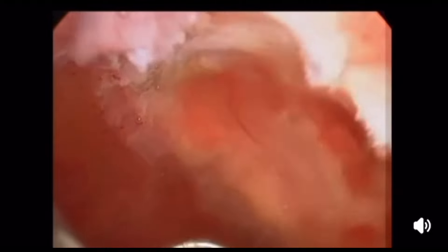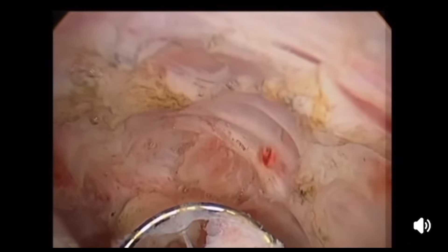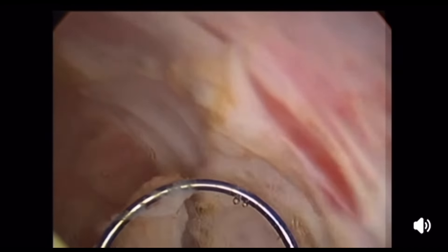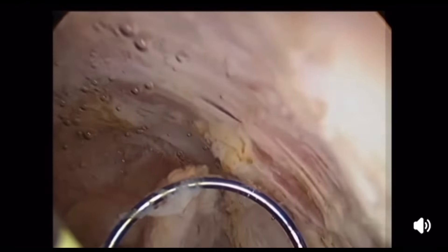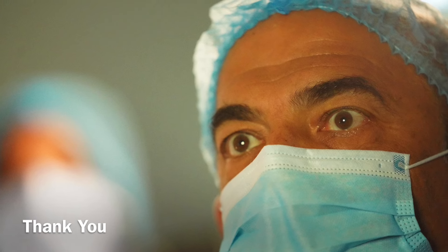At the end of the procedure, you see this bleeding point — never worry at all. It can be ignored; it will stop completely by uterine contraction, or you can simply touch and cauterize by electrocoagulation. My dear friends, I'm sharing everything I've learned in my life, every experience I had, with all of you. I hope it will be of value for everyone. This is Osama Shawki from Cairo, Egypt.